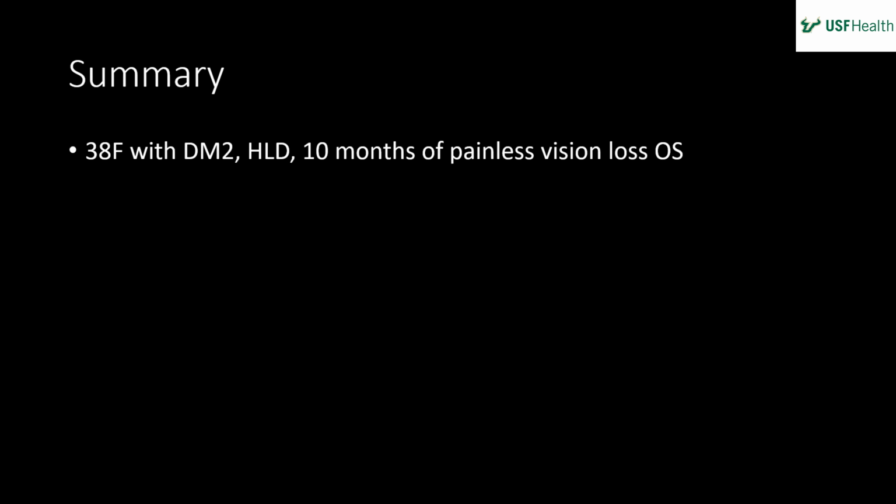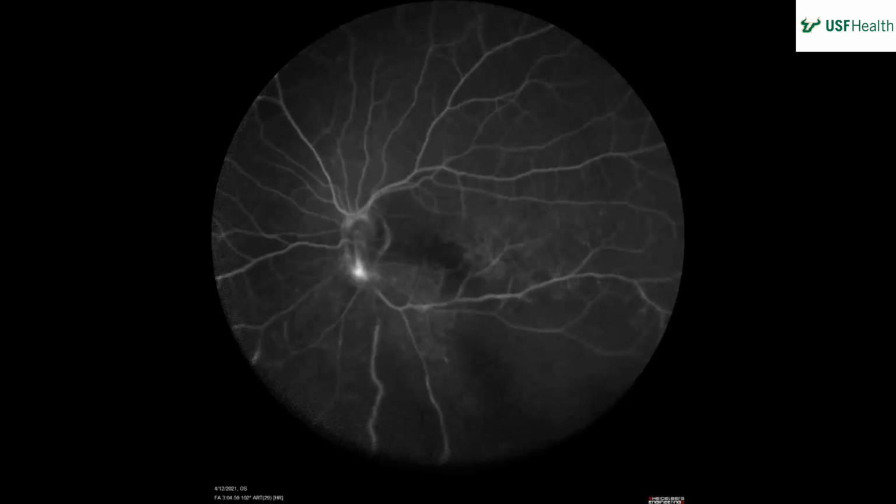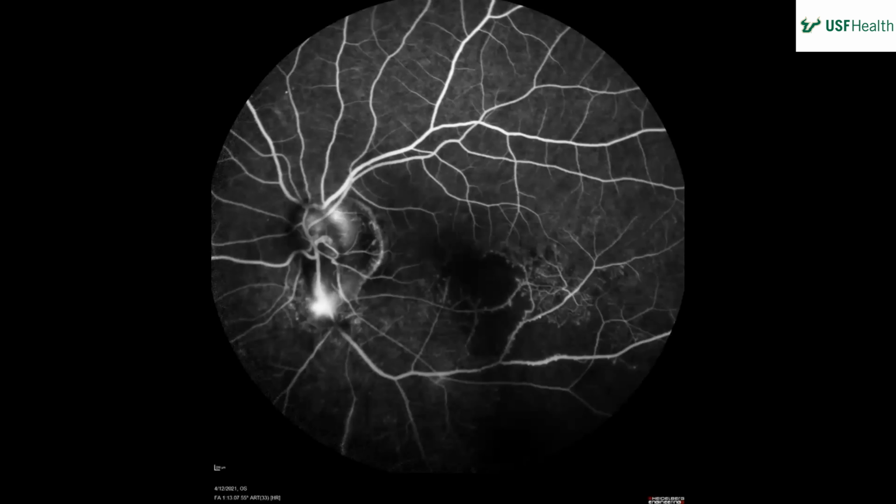Go back to the fluorescein, Grant, would you? So what area? Can you see the area? Go back one more, maybe. Go where the macula is, there. So does it look like it's diffuse or just in one area? If you can find one vascular distribution, then sometimes you can pin it on the vessel. Yeah, like a BRAO or something. Yeah, BRAO, or what other branch vascular occlusion could you have?